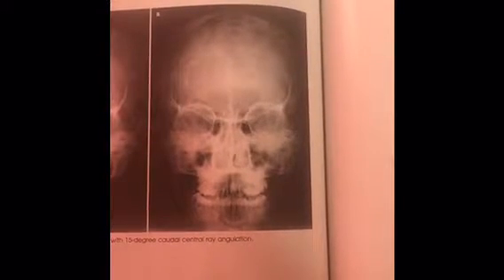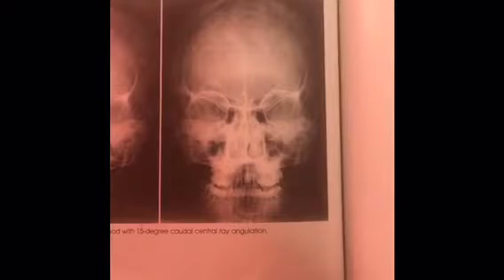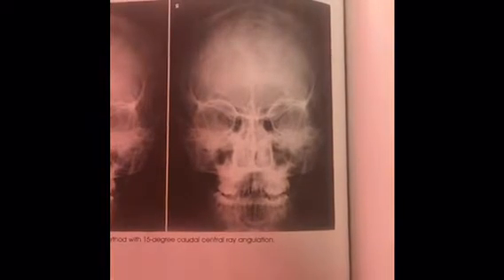This is our PA axial Caldwell method projection of the skull. The evaluation criteria is evidence of proper collimation, entire cranium without rotation or tilt demonstrated by equal distances from lateral borders of the skull to lateral borders of the orbits on both sides, symmetric petrous ridges, and the MSP of cranium aligned with the axis of the collimated field. The PA axial Caldwell demonstrates petrous pyramids lying in the lower third of the orbits, the entire cranial perimeter showing 3 distinct tables of the squamous bone, and the penetration of the frontal bone with appropriate brightness at lateral borders of the skull.